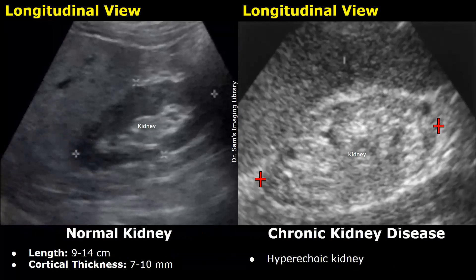On ultrasound, a normal kidney has a hyperechoic central renal sinus with a hypoechoic cortex and medulla. The medulla is more hypoechoic than the cortex. This is how a normal kidney appears on ultrasound.